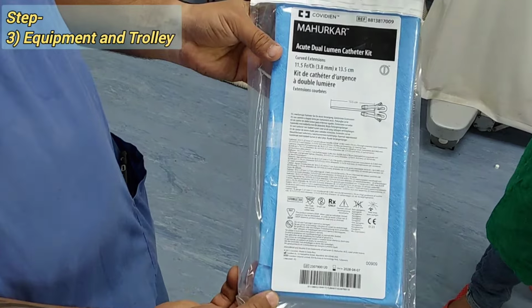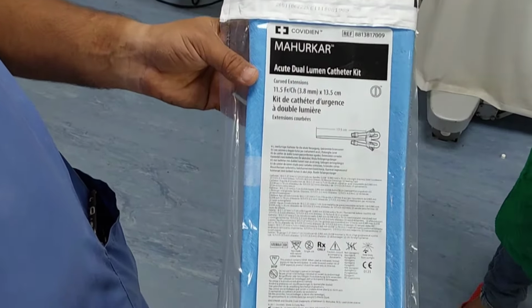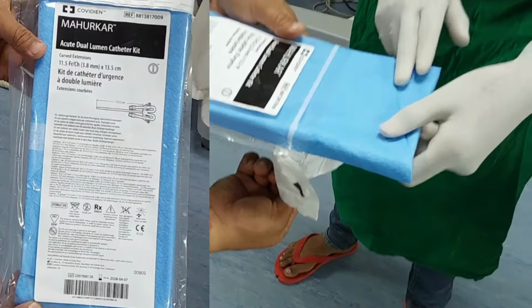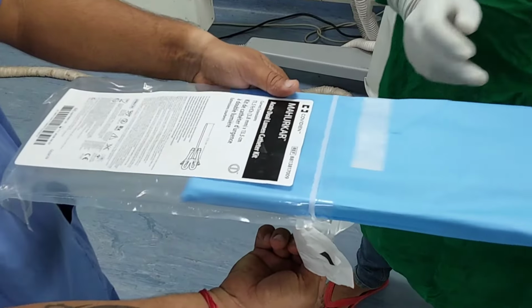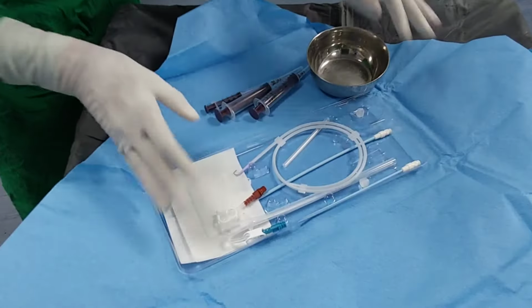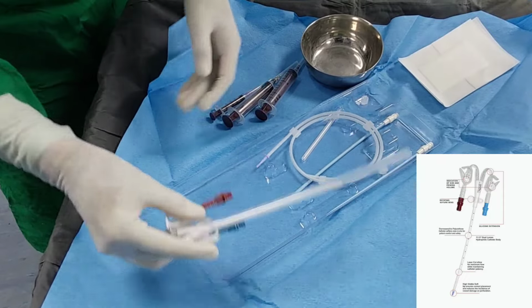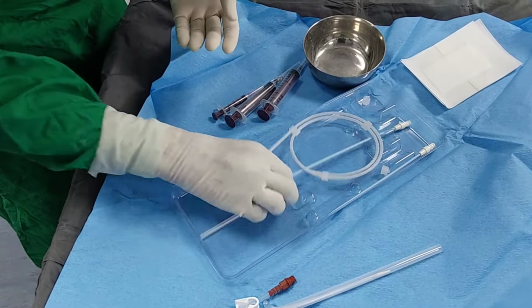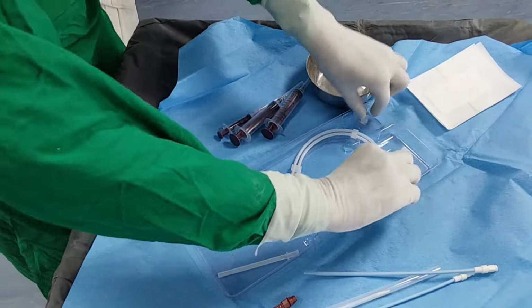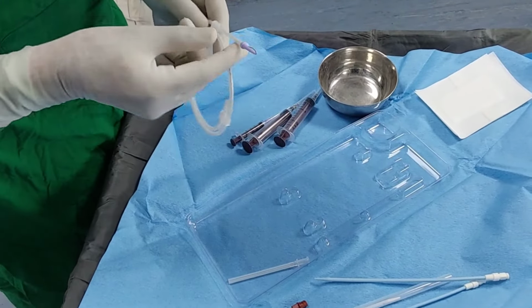Third step is the preparation of the trolley and the equipment. You can see this is the hemodialysis catheter. It is an 11.5 French double lumen catheter. It is sterile, completely sterile. Take it on the trolley. It contains 2 sterile Z-dress along with this double lumen catheter, an introducer needle and 2 dilator sheaths. One is small and one is large, and 2 stoppers, and this is a J-tip guide wire.